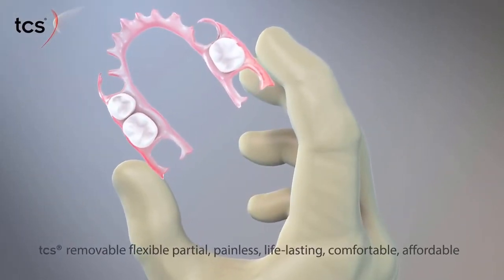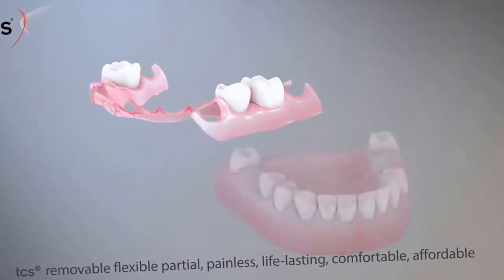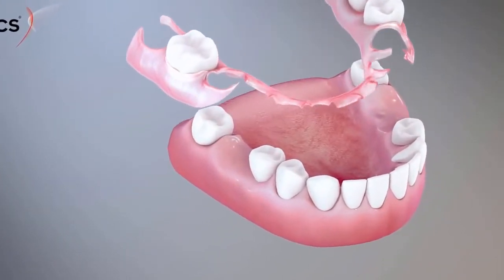TCS Removable Flexible Partials offers a painless, life-lasting, comfortable and economical solution for replacing missing teeth. The treatment is quick and non-invasive, with minimal discomfort.